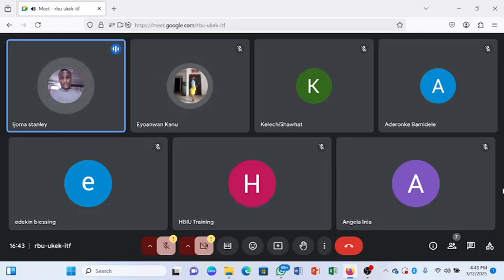You do a first urine specimen with a strip. When you dip that strip inside this, you compare it to the bottle, it will give you the number of ketones in that urine. So this is actually used to assess for diabetes. You can use it to know somebody who is a diabetic or a newly diagnosed diabetic.